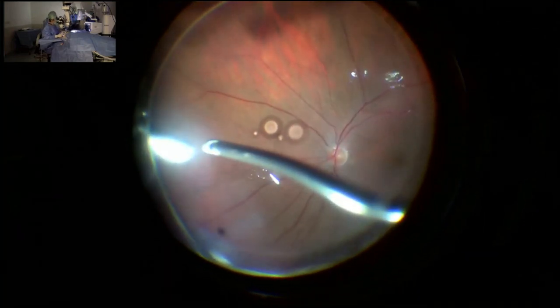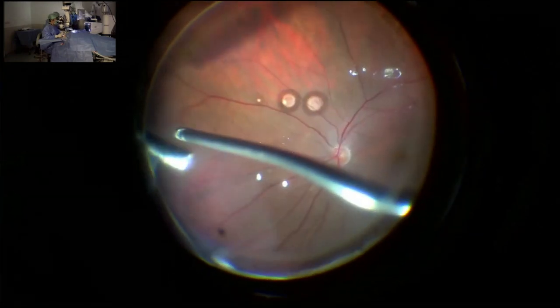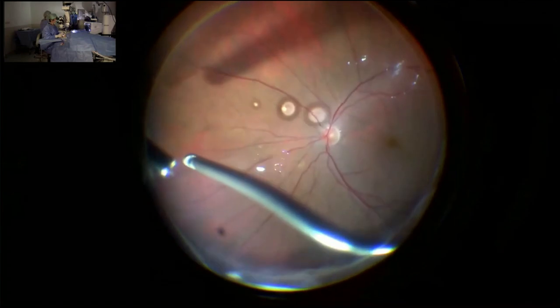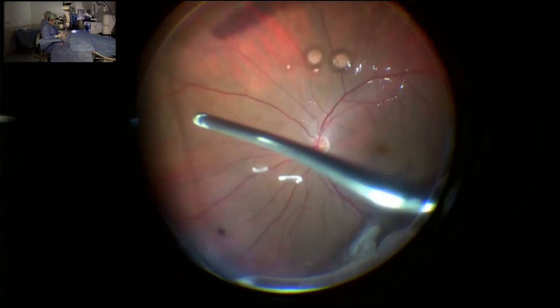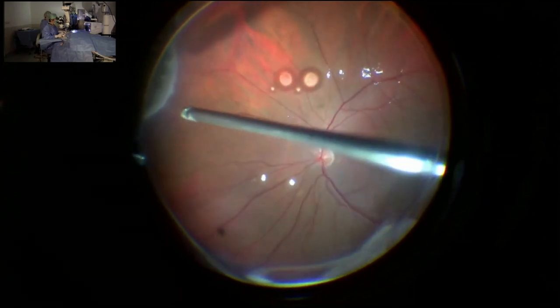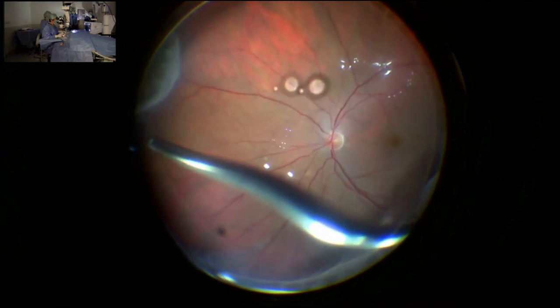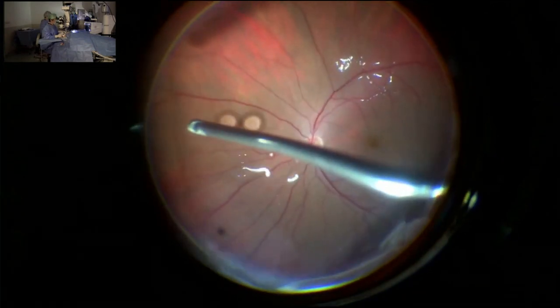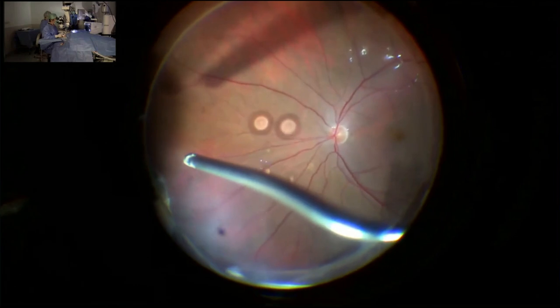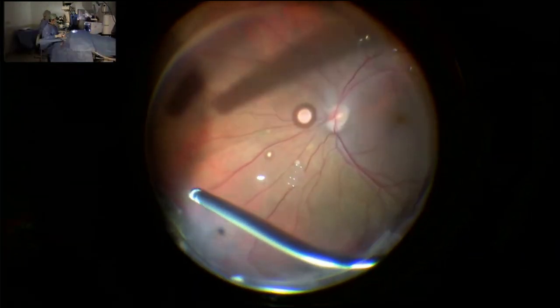So we will see the nasal part of the retina also and clean the vitreous space. It's almost finished, the vitreous base cleaning on the inferior part. These are the superior nasal part.